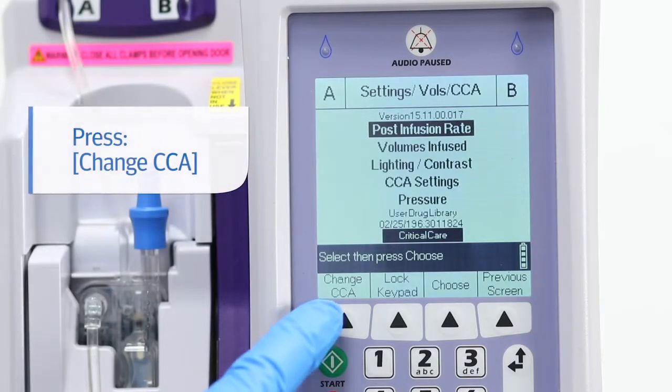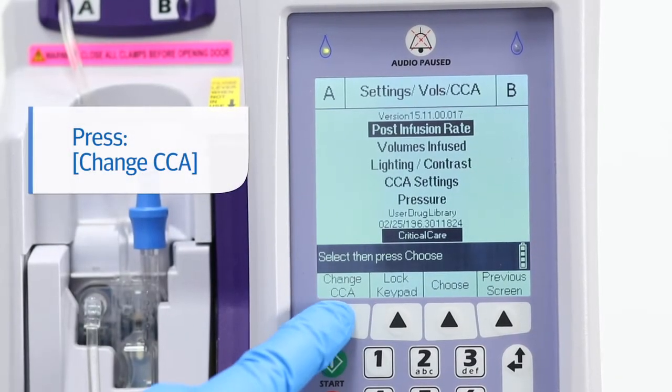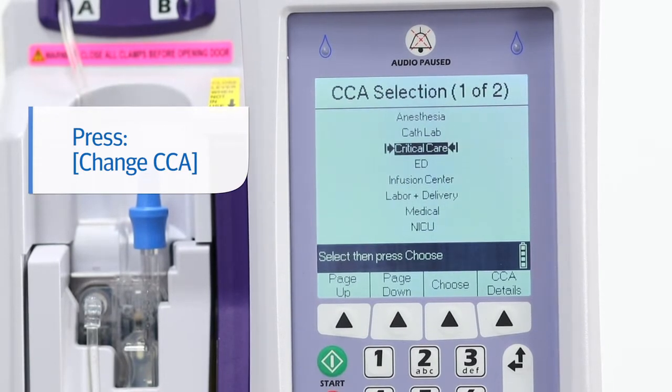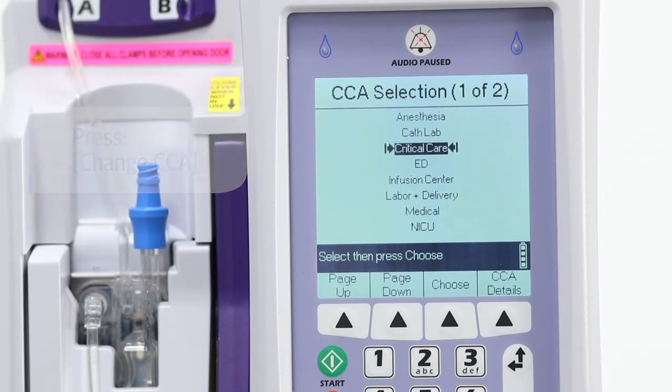Then press Change CCA. Note that the current CCA is indicated by two arrows, one before and after.